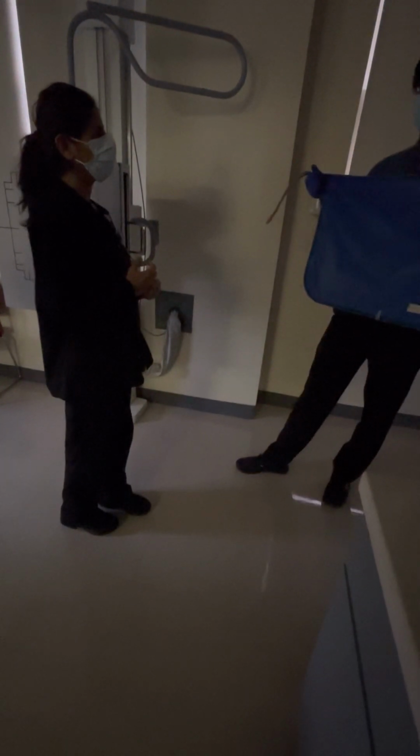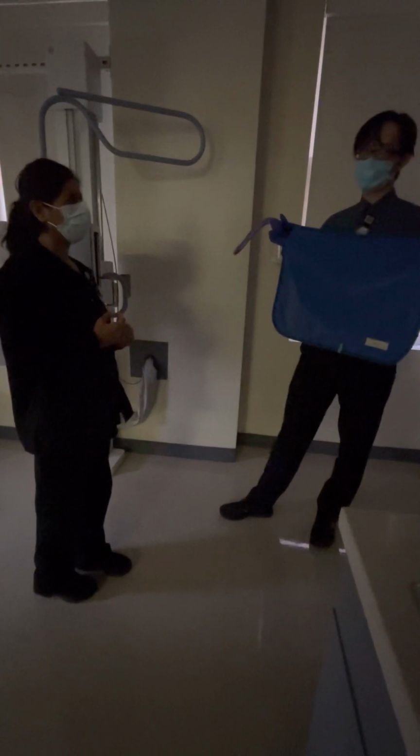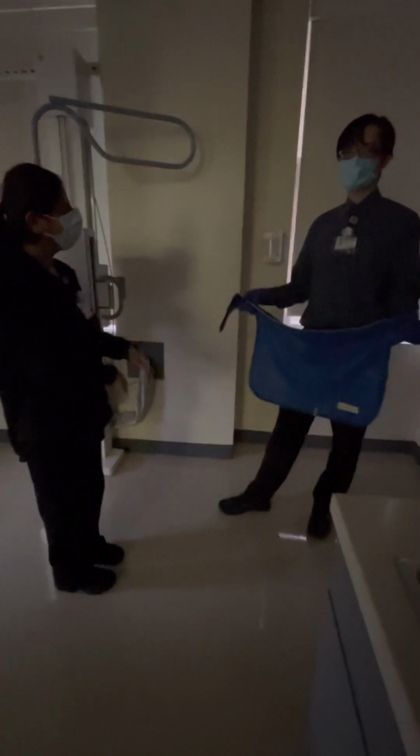Anterior and posterior obliques, right? We have RPO, LPO, right? We also have RAO, LAO. So we are going to be doing all 4 of them. So let's go ahead and just start with our PAs.